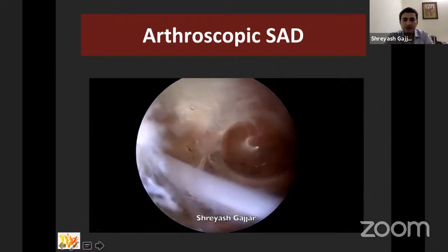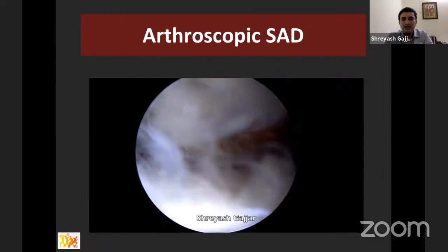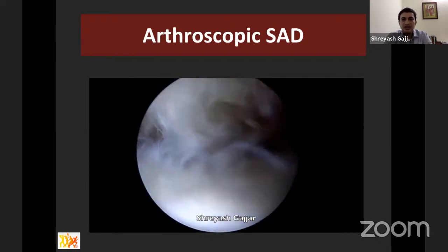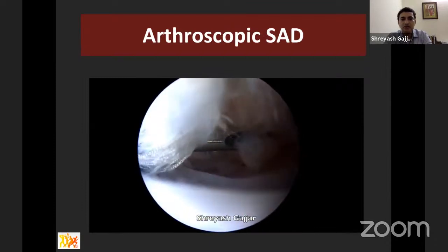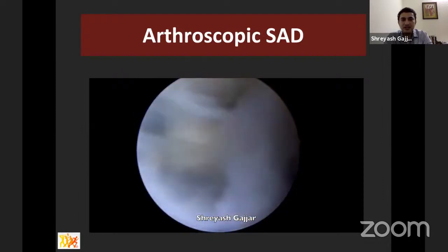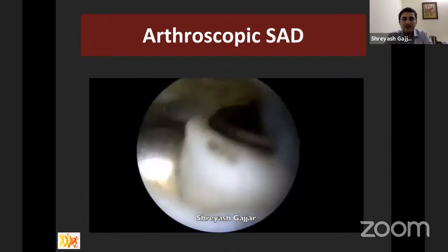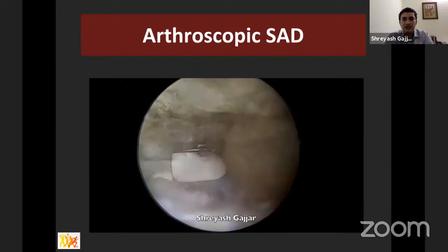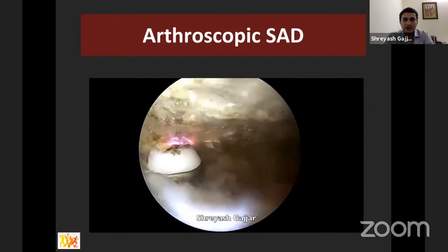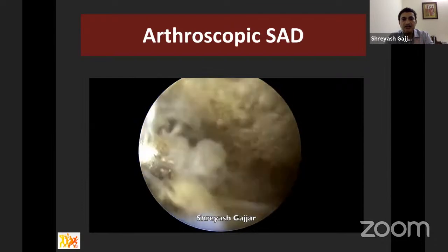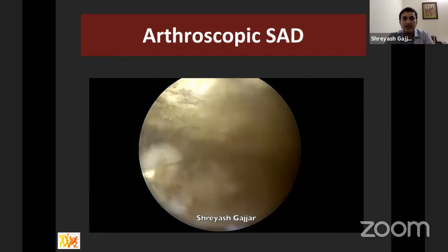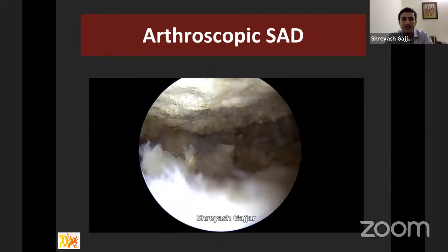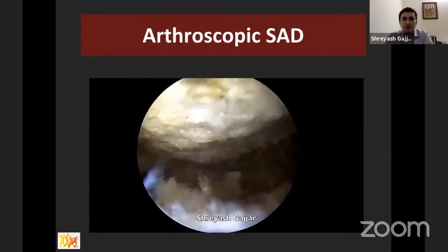This is the left shoulder in beach chair position. After gaining access to the subacromial space, fluid flow is not started until a white bursal layer is seen. The cannula is withdrawn to maximize view. From the lateral portal — two centimeters below and posterior to the anterolateral edge — access is gained and widened with a trocar. A radiofrequency device is used to feel for the acromial bone, perform initial bursa resection, and remove overhanging fibrillated acromial periosteum, followed by more meticulous exposure of the acromion both anteriorly and anterolaterally.